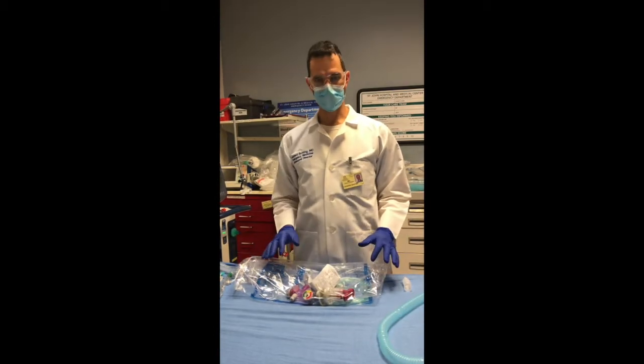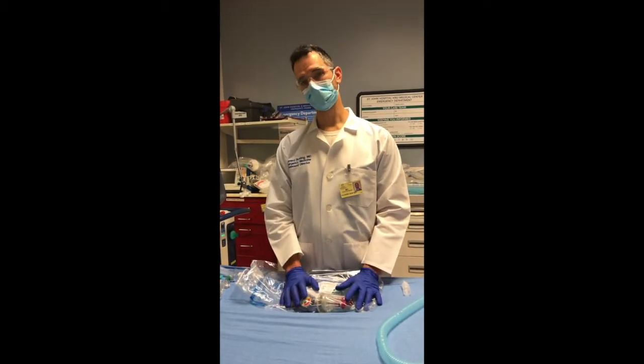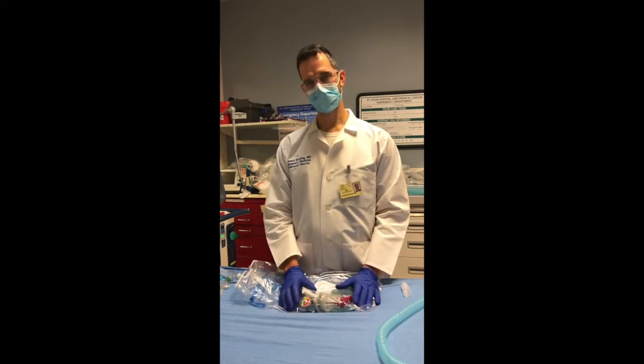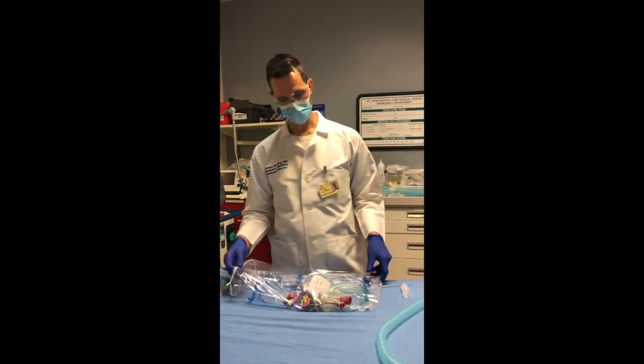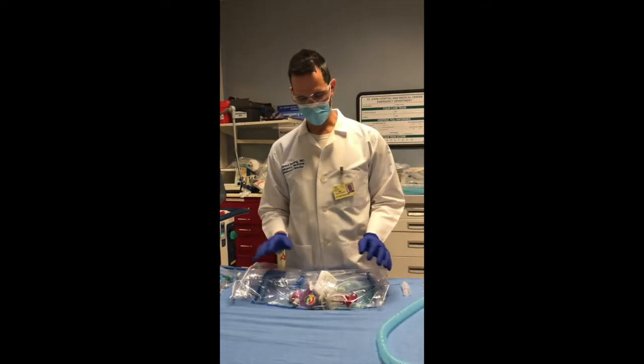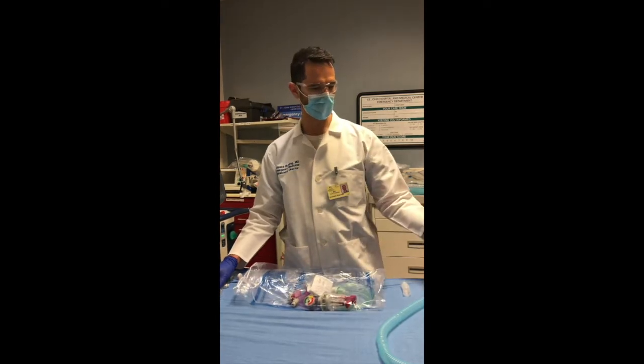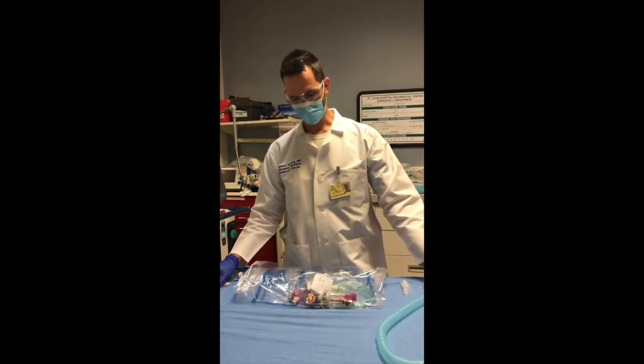Hello, my name is Leonard Bunting and today we will be going over the setup of the Vortran resuscitating ventilator. With me today is Dr. Ashley Sullivan, and special thanks to Dr. Charlene Babcock who helped come up with this setup. We're going to be going over how to set up the ventilator for a single patient and also for two patients at the same time.